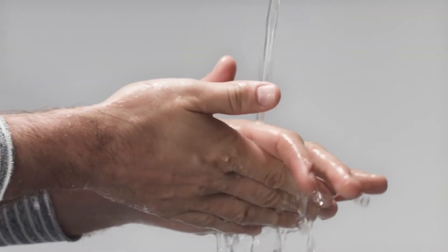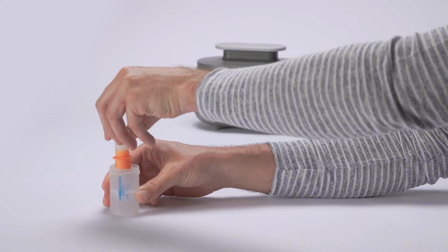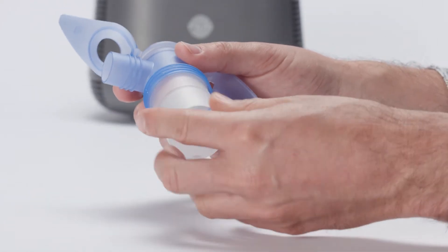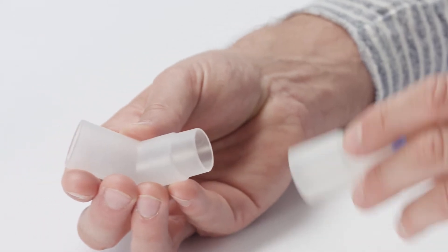Wash your hands thoroughly before every nebulizer session. Insert the orange nozzle attachment into the lower section of the nebulizer. Screw on the upper section of the nebulizer. Connect the bend and the nasal joining piece to the nebulizer chamber.